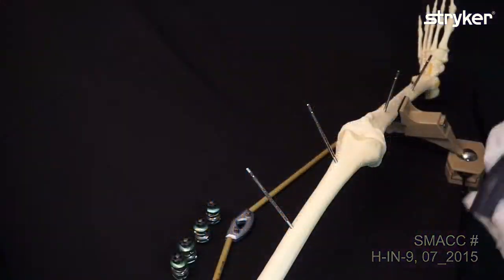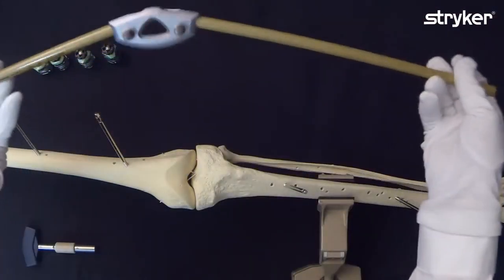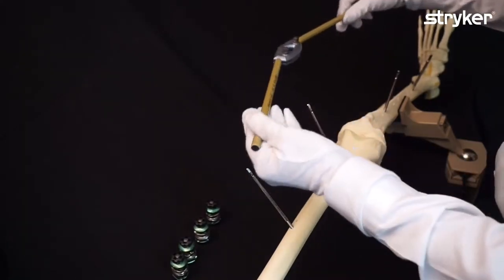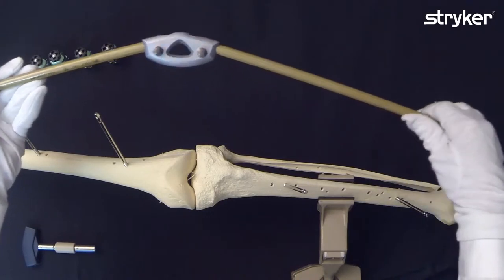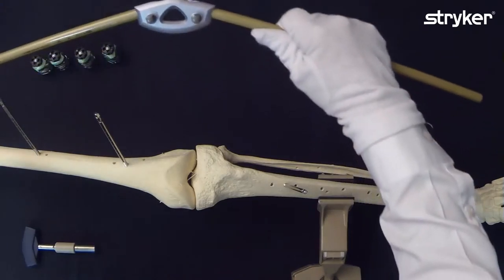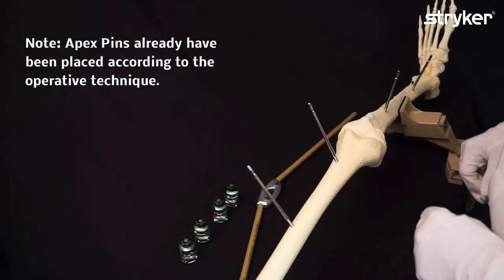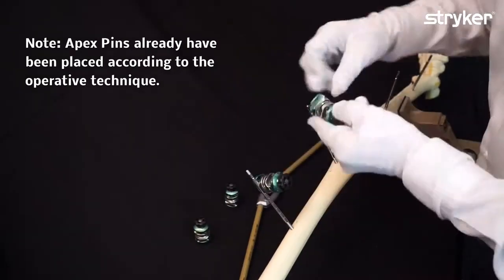As an alternative, one could also use one of those 30 degrees rod couplers, instead of the multiplanar coupling we have shown in another frame before. For the rod coupler, we recommend to actually pre-build that frame or that bow on the back table. Not necessarily ideal to do that on the patient. It can be done, of course, and it shows some versatility, but it's easier to be done on the back table. Okay, we would start with the delta couplings.